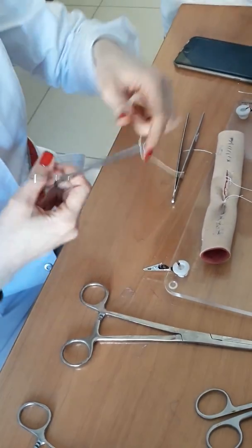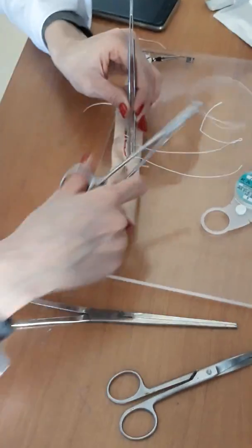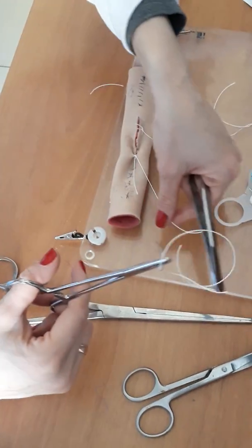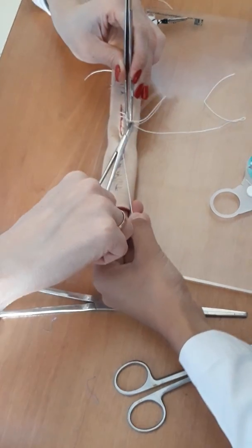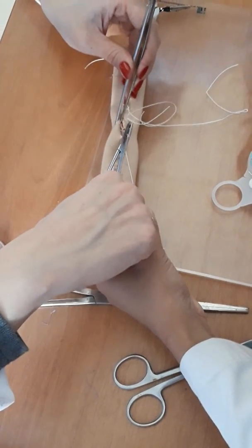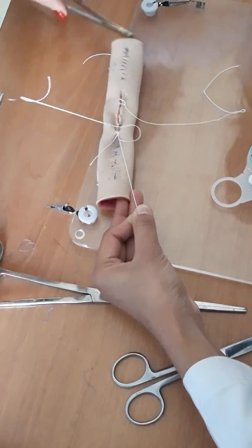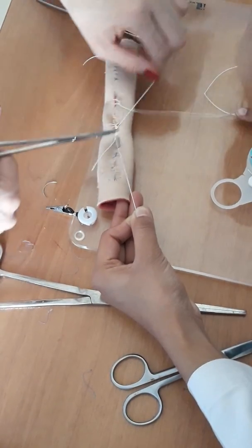The steps between may be 5 or 8 millimeters, sometimes maybe 1 centimeter. Okay, take please. Here also pierce one side, the other side, and make a knot.